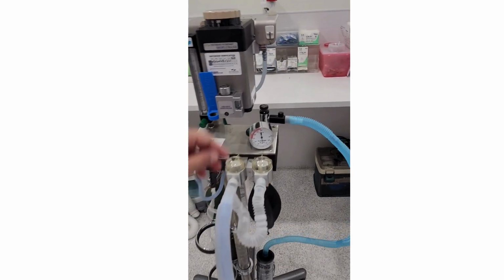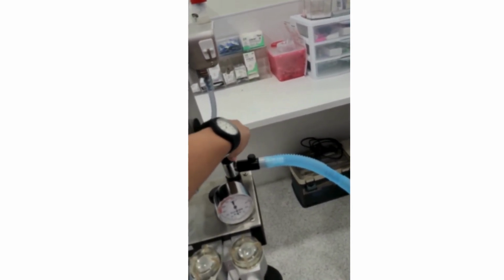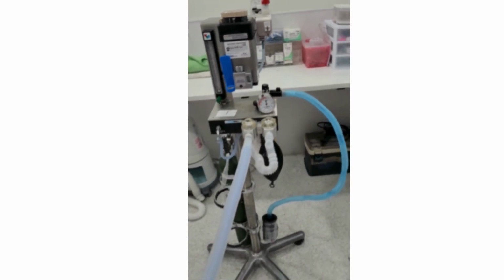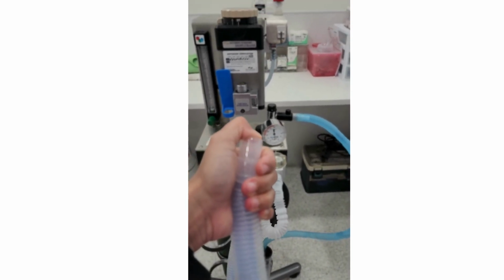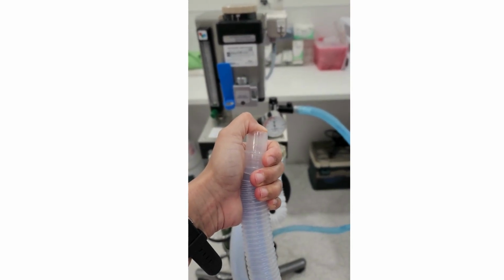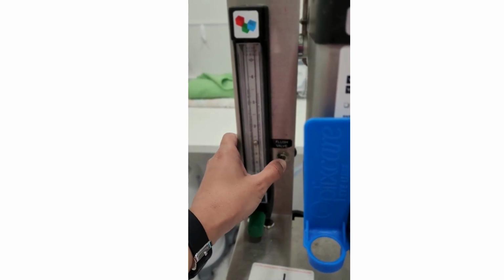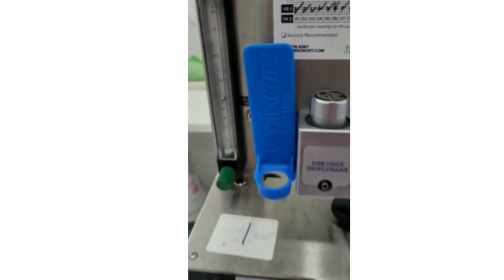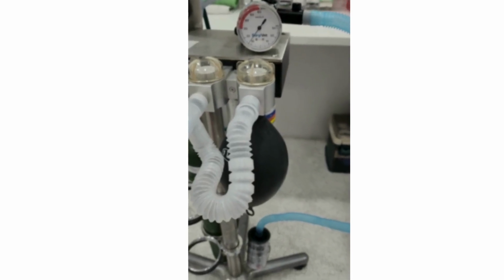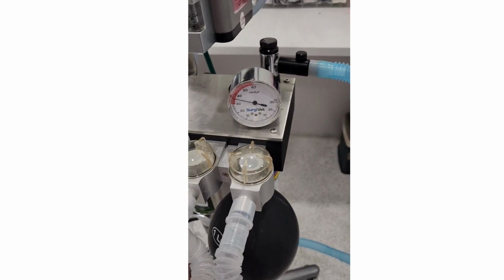Next, we have the leak test. You're going to get all your equipment hooked up, and you're going to open the O2 tank. You're going to close the pop-off valve. You're going to occlude the end of the anesthetic tubing with your thumb. Then you're going to flush oxygen until the manometer reads 20 to 30 centimeters of water. You want to make sure that the manometer won't drop more than 1 centimeter per second. If that happens, then you have a leak.